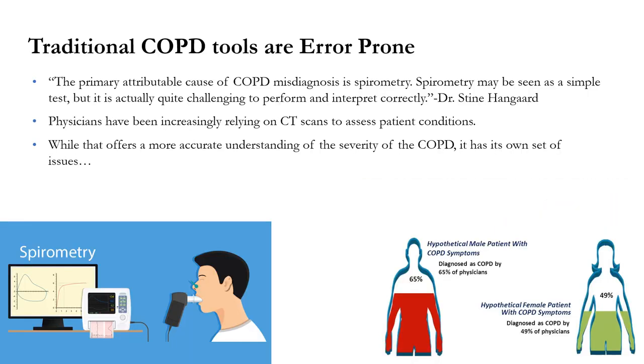A core tool used in COPD diagnosis, spirometry, is error-prone. Dr. Stein Handgaard, a leading researcher in this field, has demonstrated that spirometry values can vary based on training and other variables, which does not make the process consistent and objective.